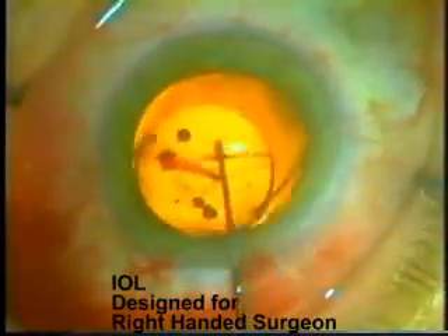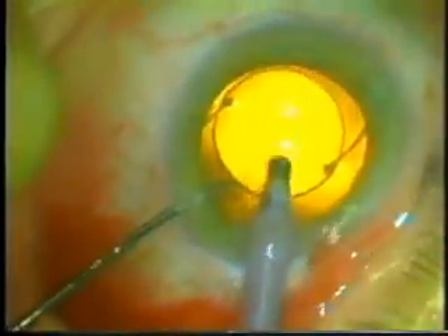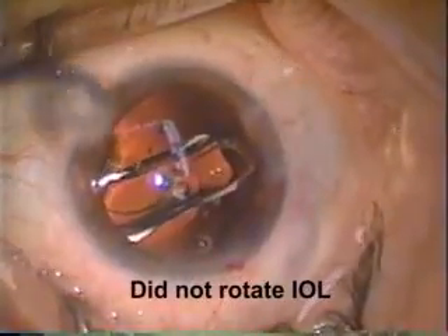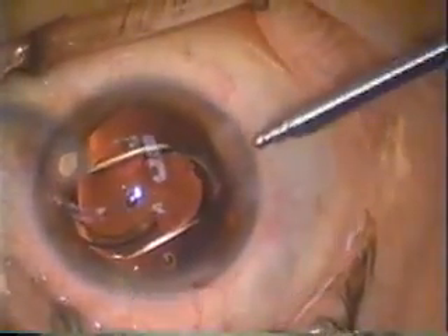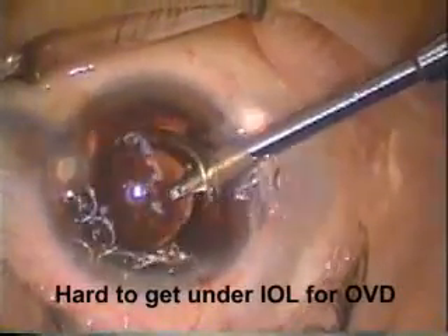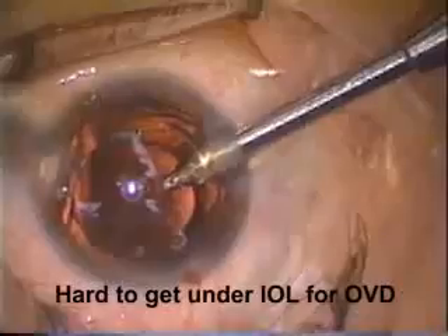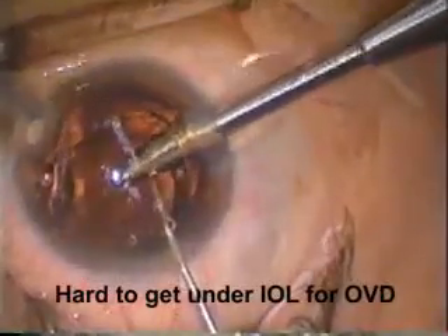Now the lens is rotated 90 degrees, which allows us to get under the optic to remove this bit of hemorrhage. Here's a time when I did not rotate the intraocular lens, and you can see that when I left it in that position, it made it very hard to remove the viscoelastic as the trailing haptic got in the way. Cataract surgery is like billiards — you need to plan ahead for the next step. In this case, I didn't. I should have rotated it 90 degrees.